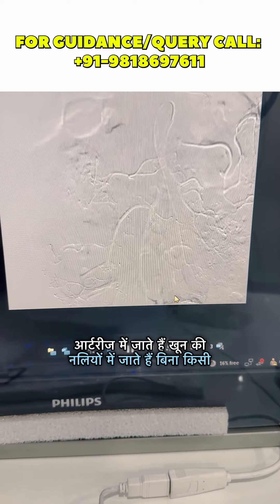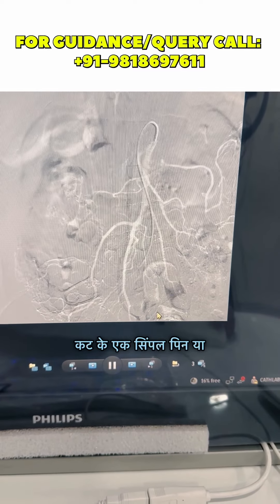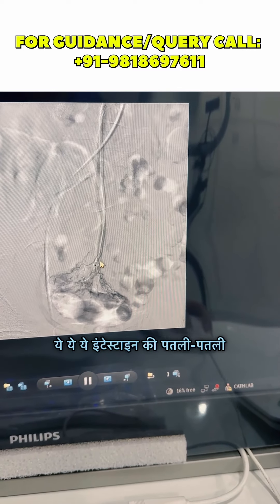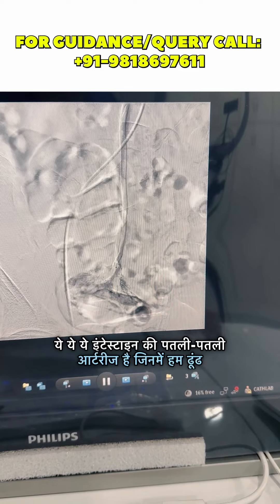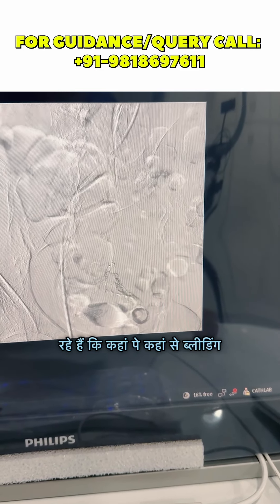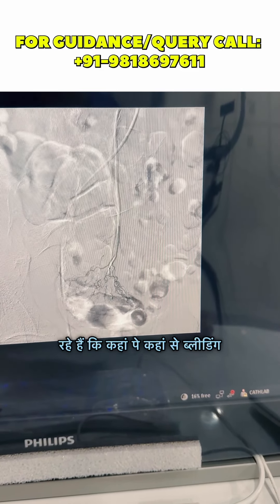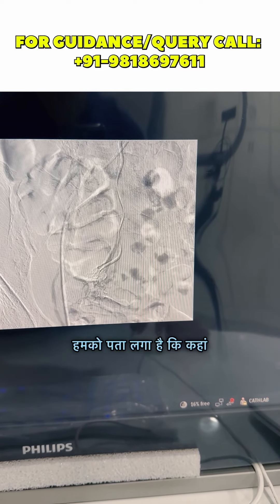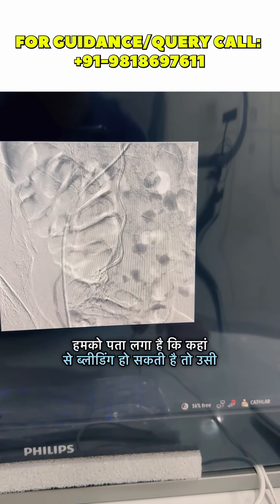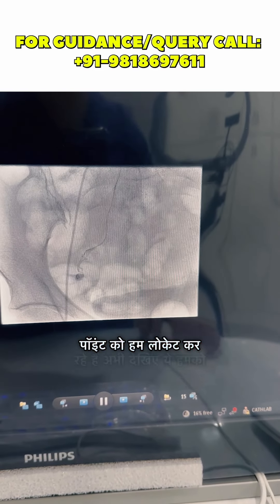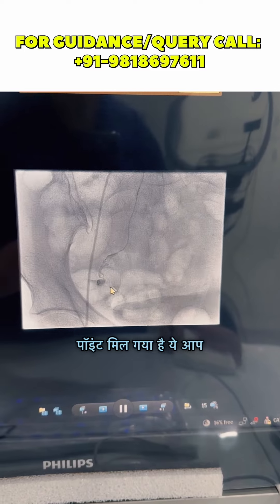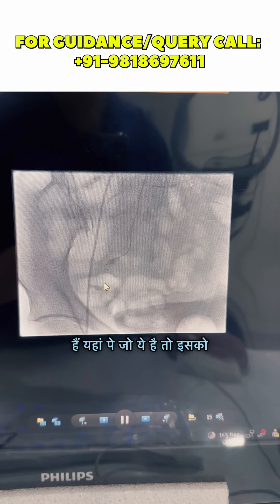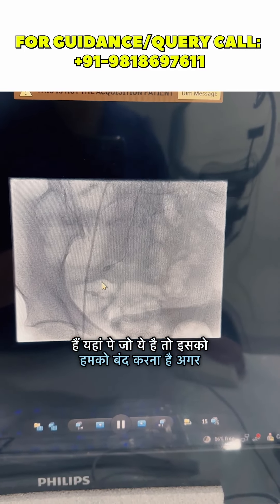Without cutting — with just a simple pin or needle — we look at the intestine arteries to find where the bleeding is. With CT, we found where the bleeding is, and we located the same point. This is the point. You are looking at the small intestine — this is the part we have to close.